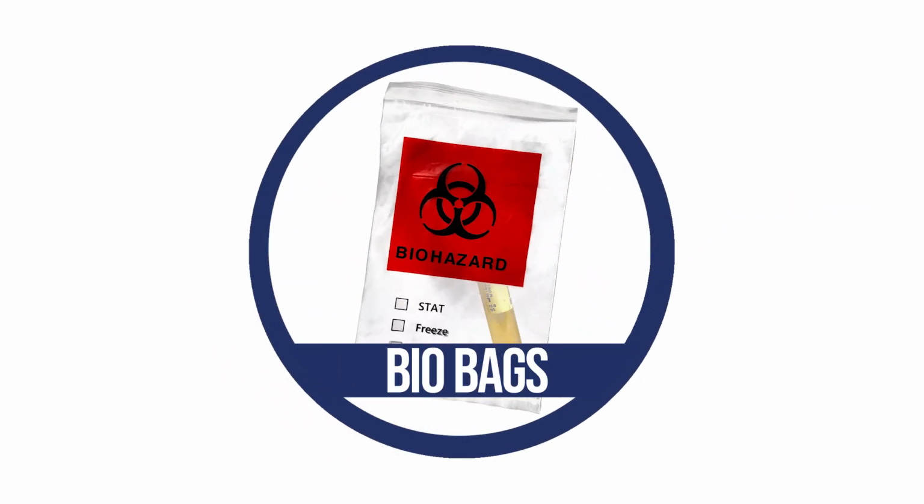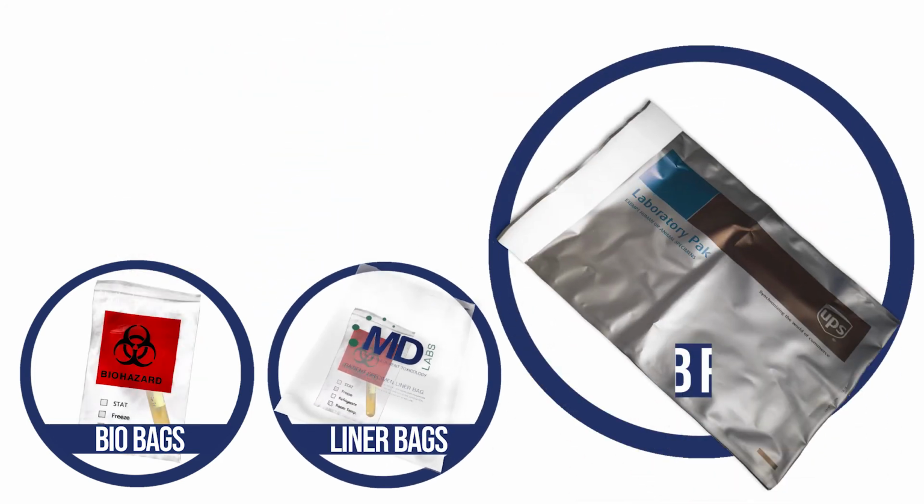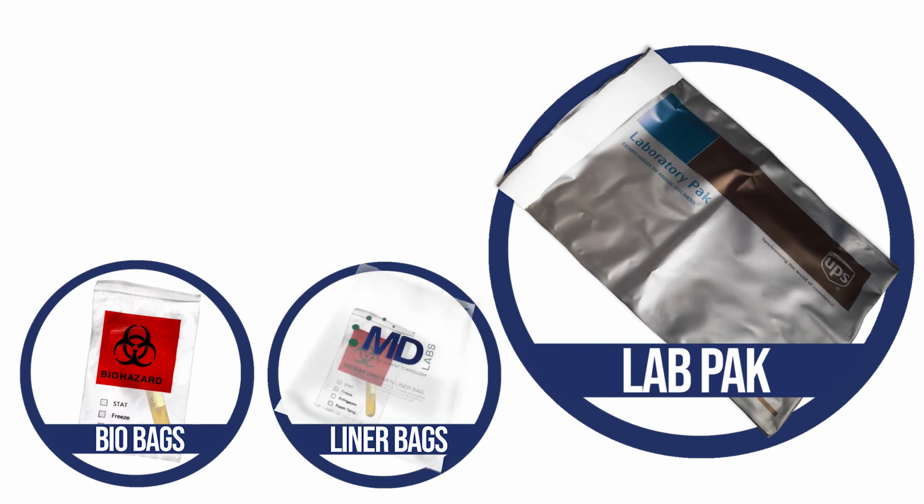All the biohazard bags containing the specimens in the zip-locked section with the paperwork in the outer pouch from that day's collection are then placed into the MD Labs liner bag, which is then placed in the UPS or FedEx lab pack for transport to the laboratory.